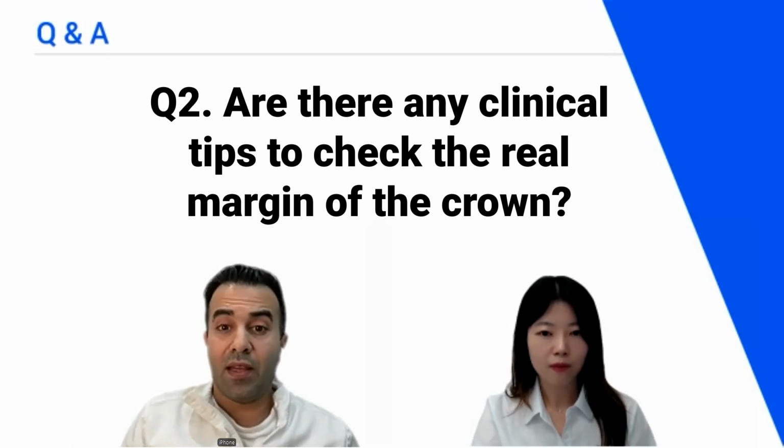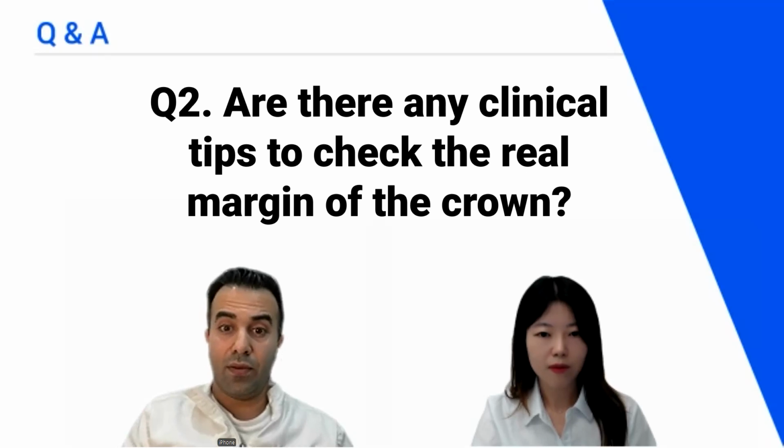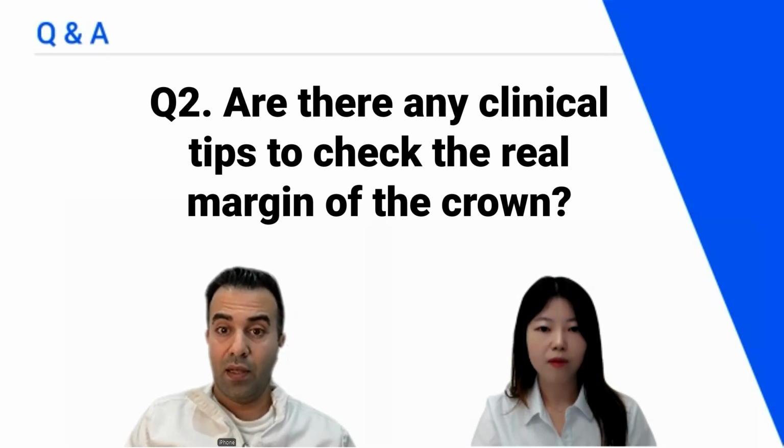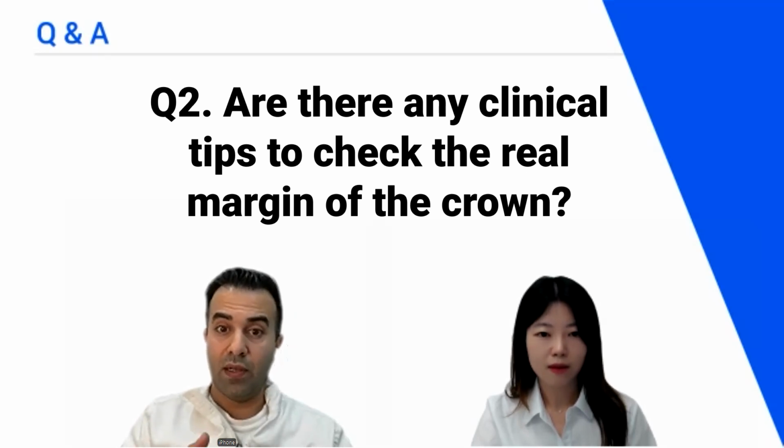And that's the answer. And the other tip that I would give, obviously, when we export the scan to the lab, I would recommend exporting it in PLY format rather than STL format. And the difference, we know already, the PLY is like an STL 3D file, but it has color. And the technician usually can switch the color on and off. And obviously they'll use the pink and white to distinguish between tooth and gum.